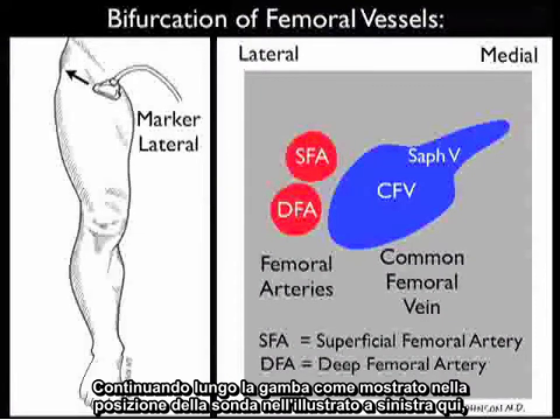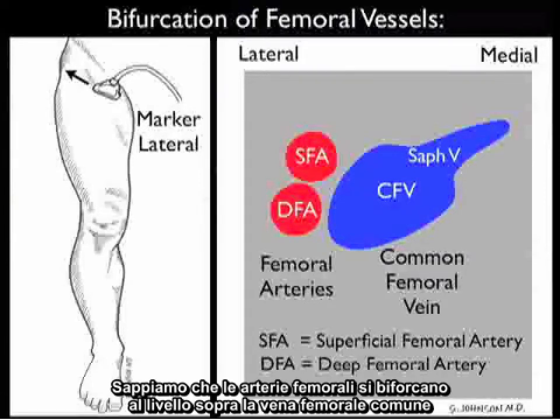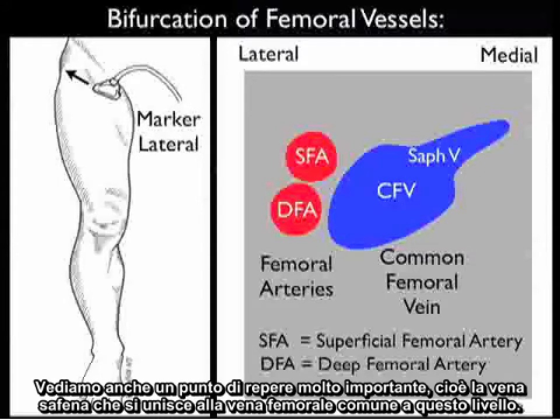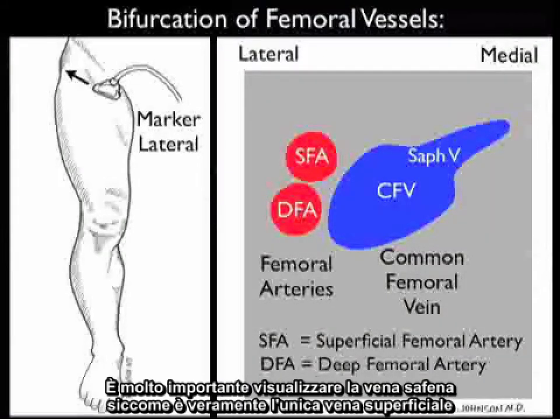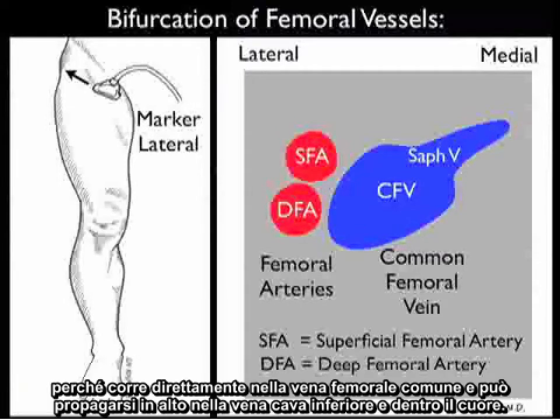Continuing down the leg, we note that the femoral arteries bifurcate at a level above the common femoral vein, and here we see the superficial and deep femoral arteries just lateral to the common femoral vein. We also see a very important landmark — the saphenous vein joining into the common femoral vein at this level. It's very important to visualize the saphenous vein as it's really the only superficial vein in the body that we worry about clot formation within, as it goes directly into the common femoral vein and can propagate up into the IVC and into the heart.